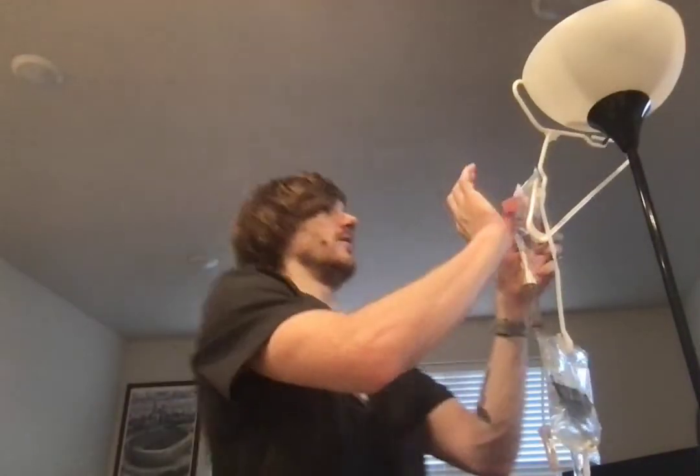I would also want to make sure that, taking my gloves off, performing hand hygiene before I leave the room, I'm going to label my medication, amoxicillin, with what it is. That way there would be no potential cause for error with other employees or healthcare workers not knowing what that medication running would be. I would make sure my patient is comfortable and that they were aware of any potential side effects with the administration of the fluid and medication, and I would go and document all of this that I did, and that is it.